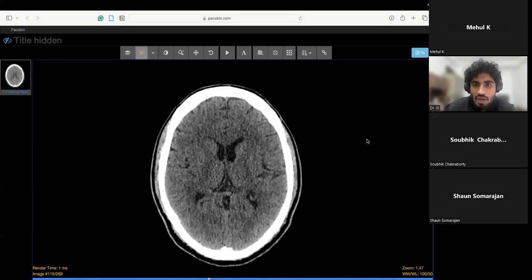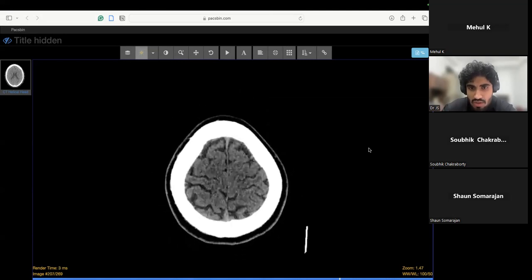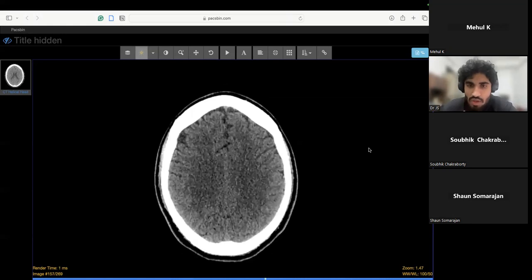Now coming to that, we have learned about the window level, window width, and attenuations and various aspects. So now we'll go through some part of it. Knowing the terms is one thing, and there is a skill part and there is a practice. Knowledge is one thing. We have learned about the CT scan in our MBBS and other days as well, but we did not put the knowledge into practice. So the skill will be almost vestigial.